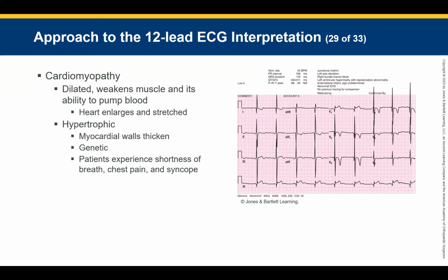The Doc in the Box says junctional rhythm. It means the P wave is missing, and that's possible to do, that right there. There's little bumps there. I can see them. They're not great, but they're what I would call clear and identifiable. That one's real clear. Here's the other thing you can do. Look across the board. I see why it's saying junctional, and now I get it.